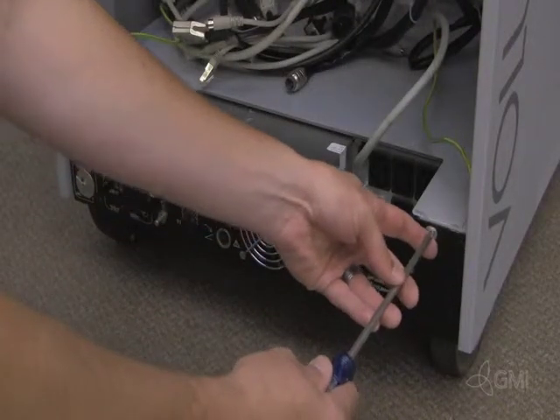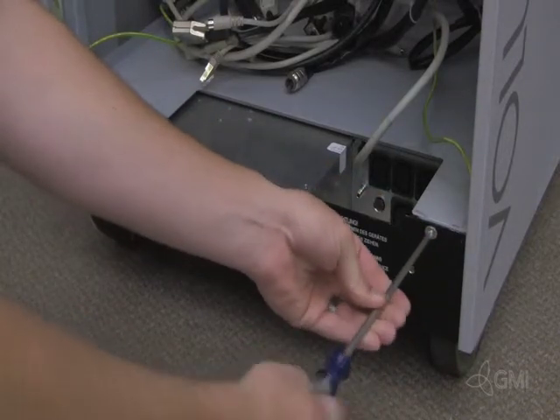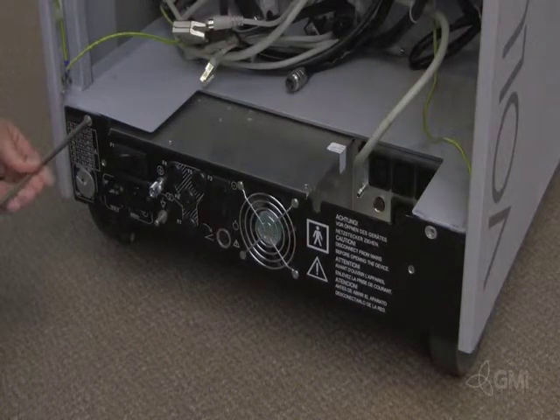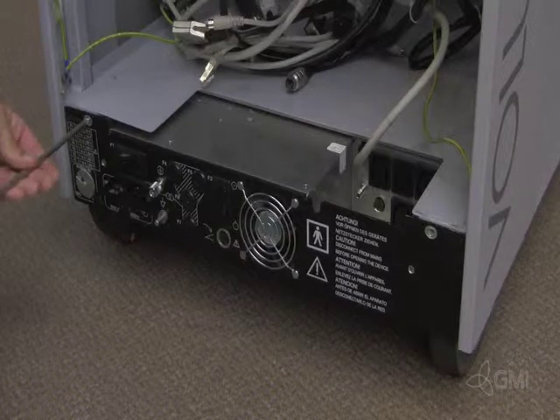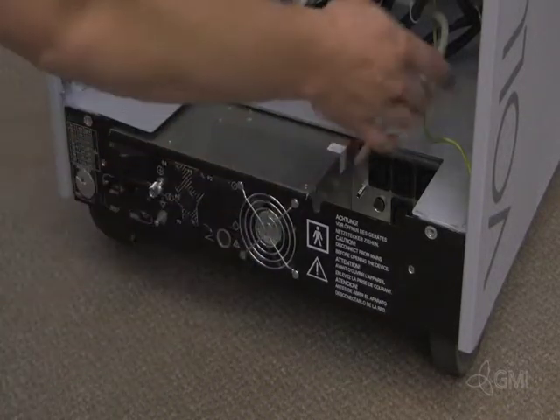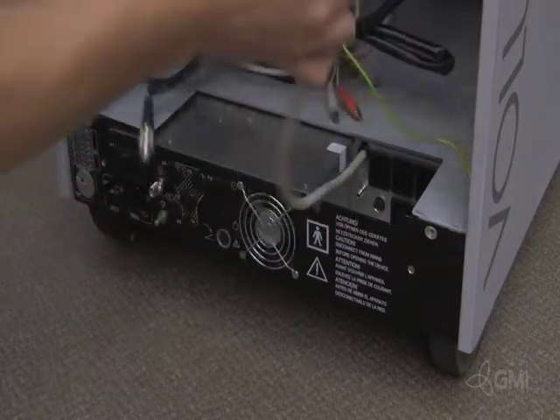Remove the two screws that secure the CPN to the chassis. Make sure that the e-box power cable is free of other cables.